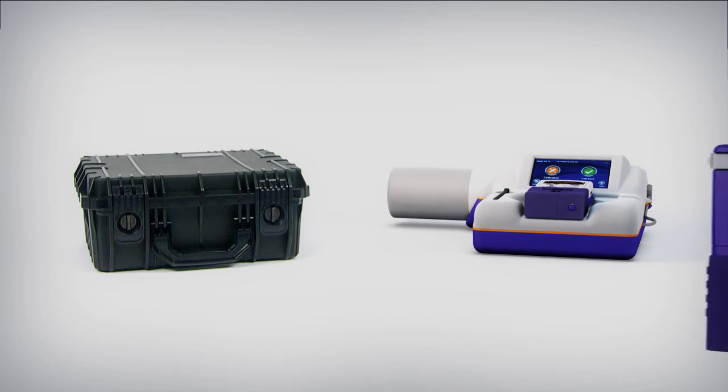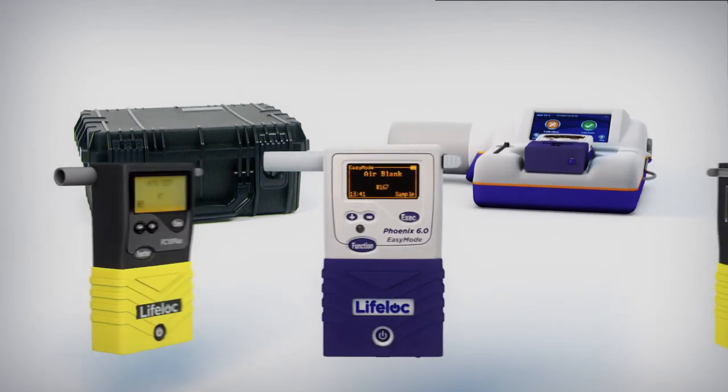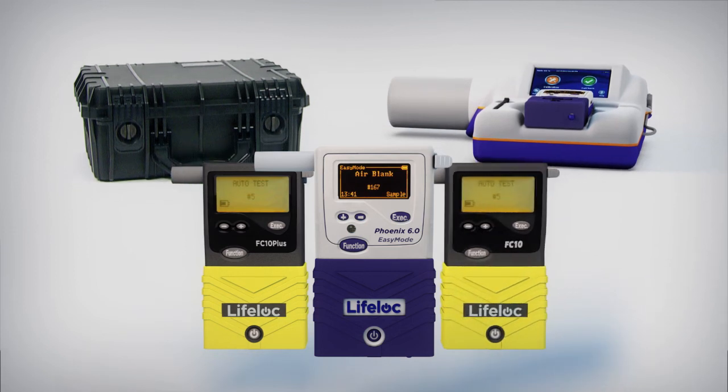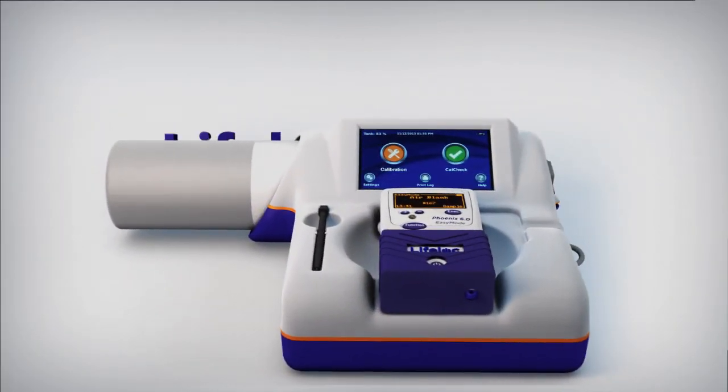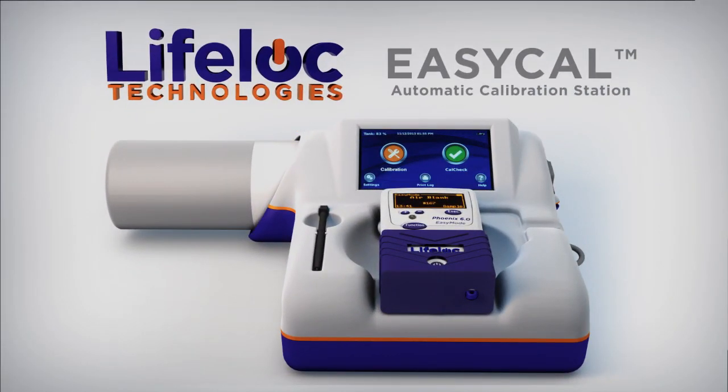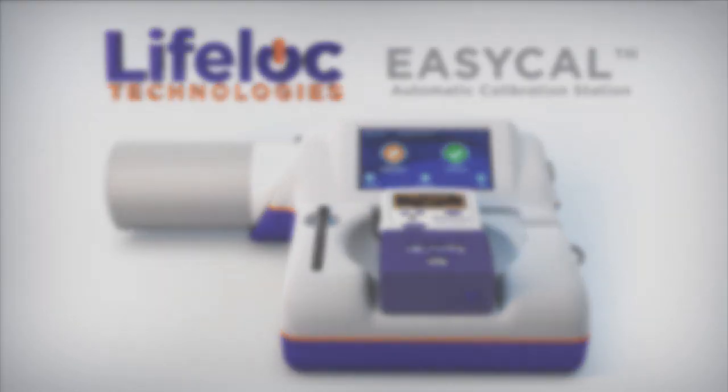And best of all, EZ-Cal is compatible with all recent LifeLock FC series and Workplace series instruments. Breath tester compliance has never been this easy. Just cradle your unit, power on, and EZ-Cal does the rest.